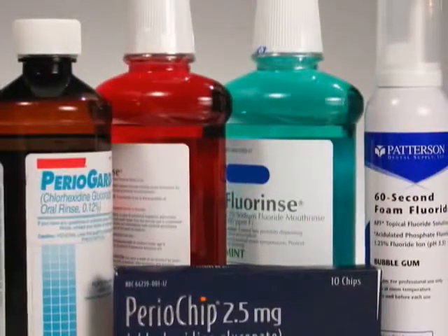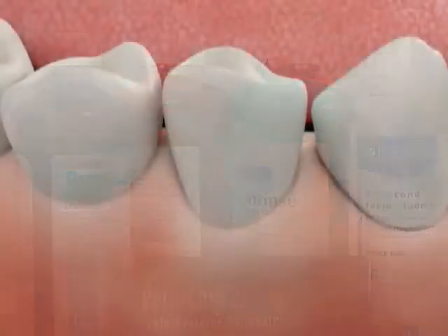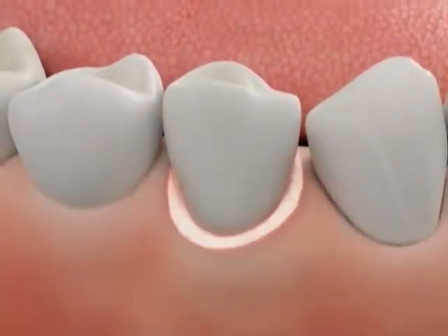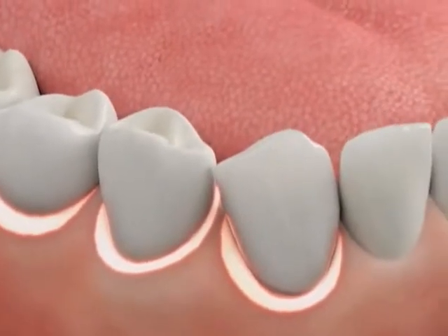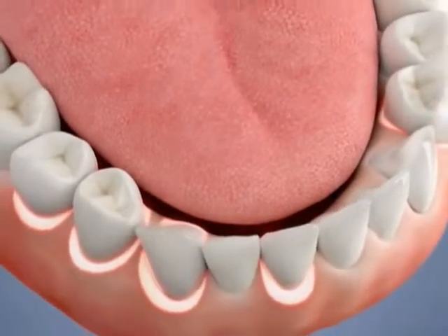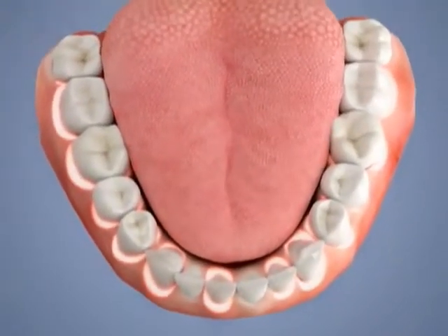Depending on your situation, we may also apply fluoride or a medication to the area. If you have just a few pockets of infection, we may treat just those teeth. But if the infection is more widespread, we may treat one or two quadrants of your mouth at a time, spacing the treatment over several appointments.